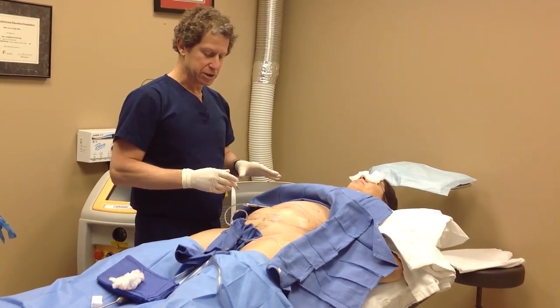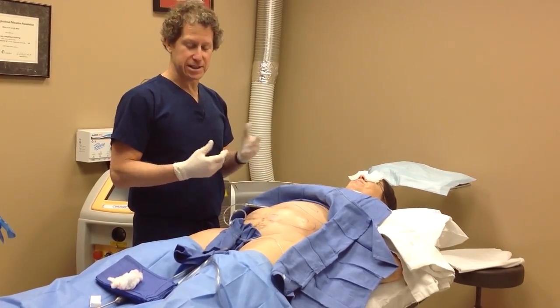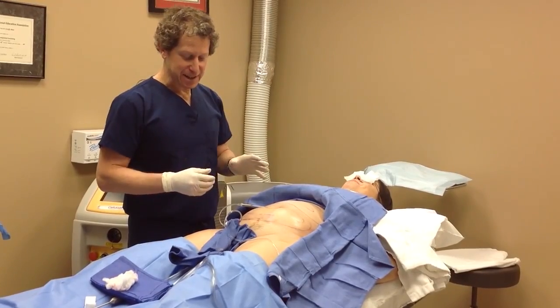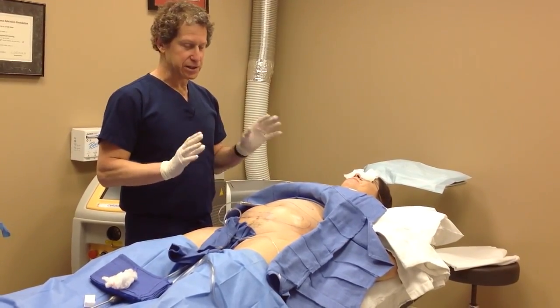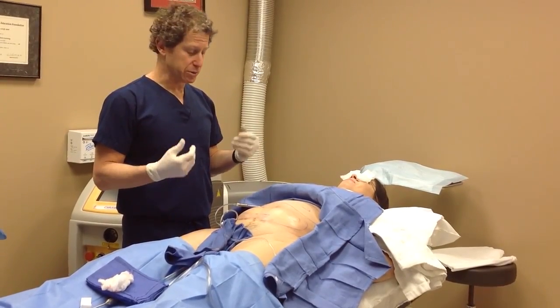I'm about to start a smart liposuction case right now. This lady is wonderful — she's wide awake and hasn't had any sedation. I've already seen her previously, explained the whole procedure and what's involved.